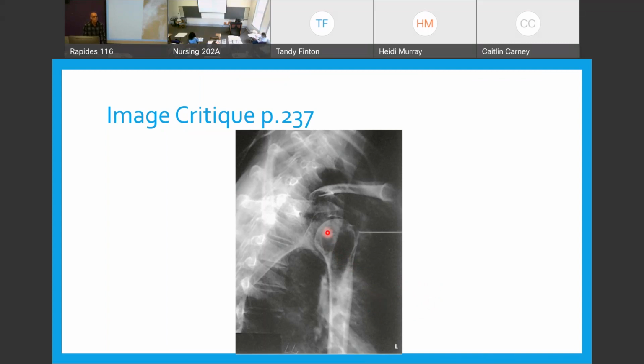This is the affected arm. So we're not going to let them do what? They're not going to be lifting and moving and doing anything with this arm. So we have to what? Keep it stabilized, shooting through this side, transthoracic.